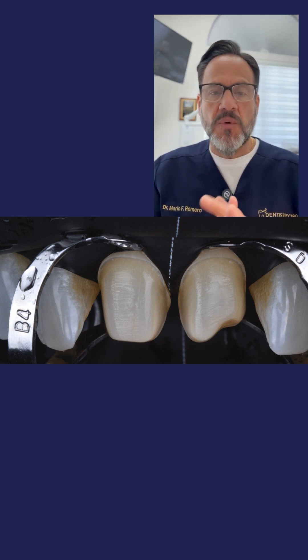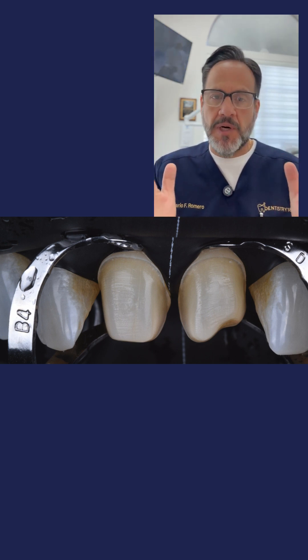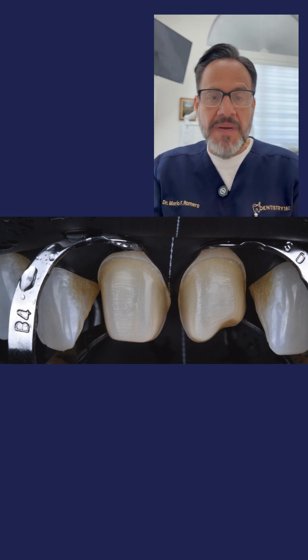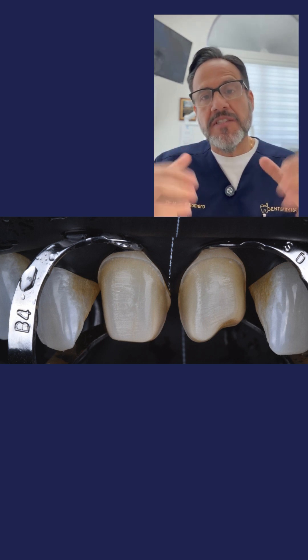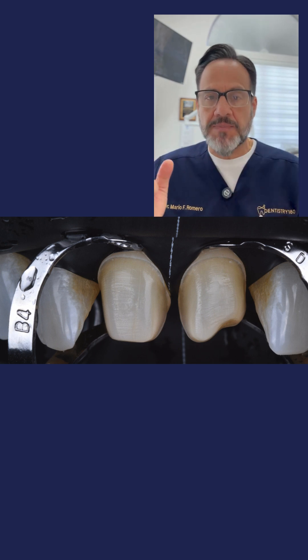What are the tricks I want to share with you? Number one, you need to do these perforations at least five to seven millimeters apart. If you don't perforate your rubber dam with this separation between your perforations, you're going to have some tissue exposed. So you've got to make sure that there's no tension between each of these perforations.